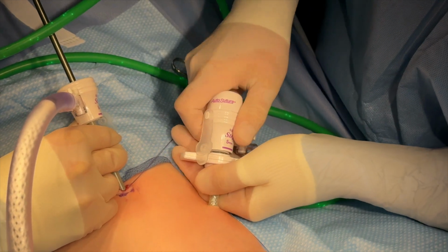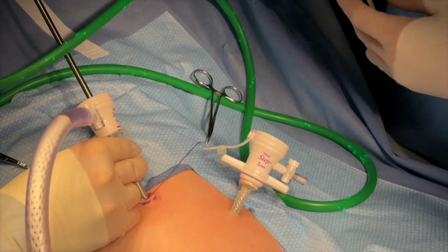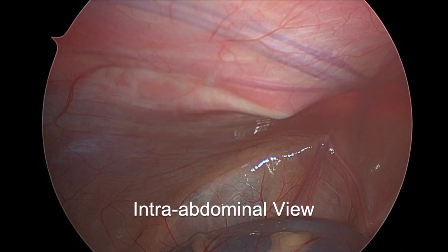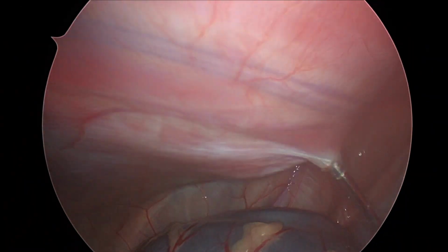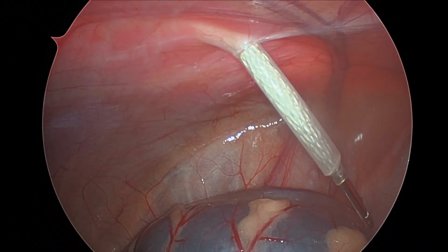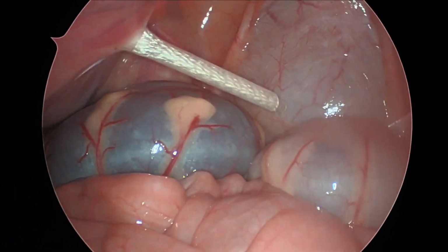The outer sleeve is grasped while the cannula and obturator is angled anteriorly. A constant twisting motion is applied while the cannula is advanced. A 5 mm port site can be expanded to accommodate a 10 mm port by removing the cannula while leaving the sleeve in place, followed by insertion of a 10 mm cannula and obturator in the same fashion.